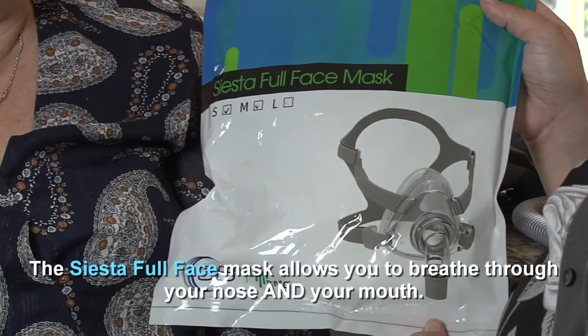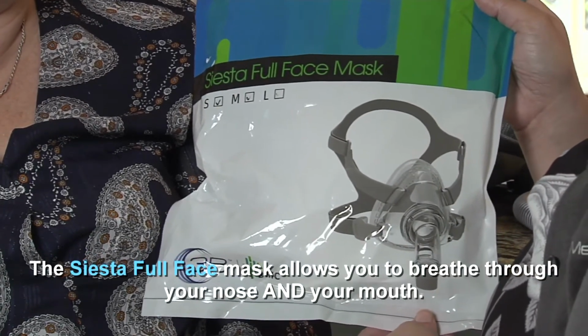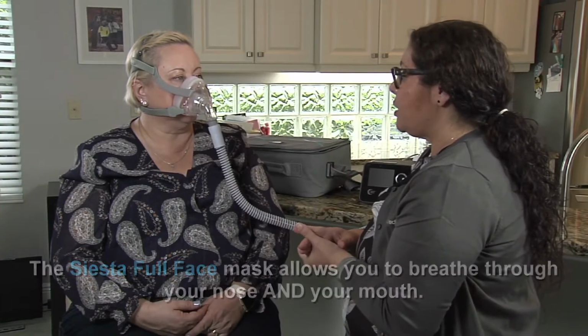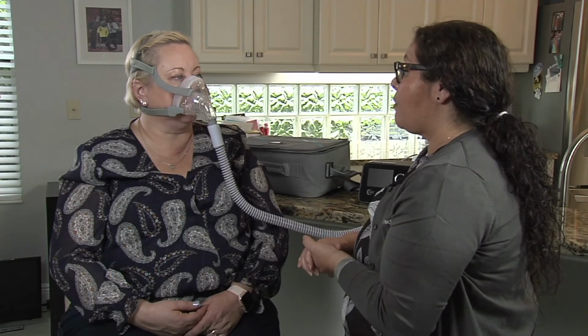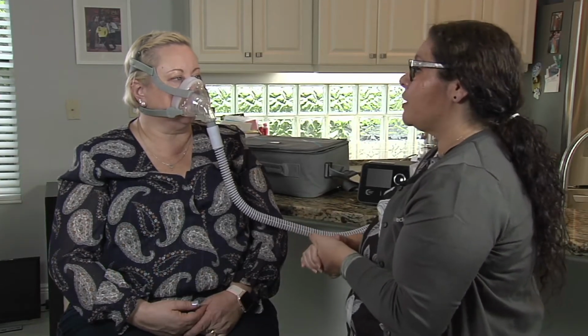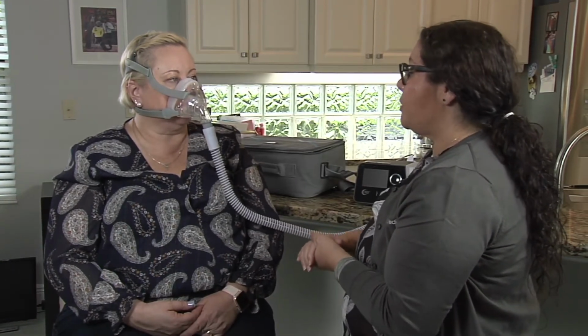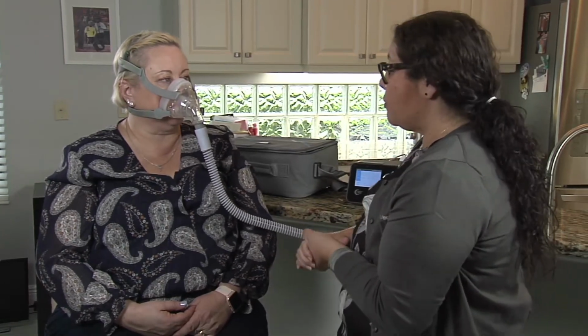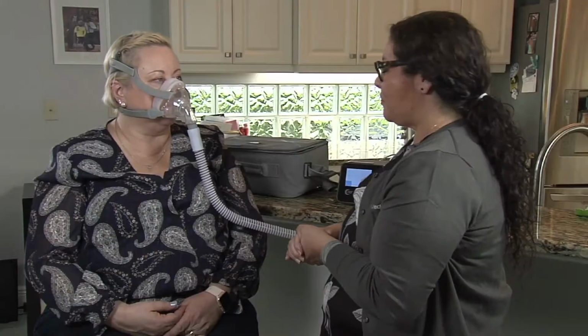One of the great points of wearing a full face mask is that you can breathe through your nose and your mouth. So if you have some nasal congestion, feel free to open your mouth. The air might feel a little funny traveling through there, but the therapy will still be effective. Try to breathe normally. How does that feel? Perfect.